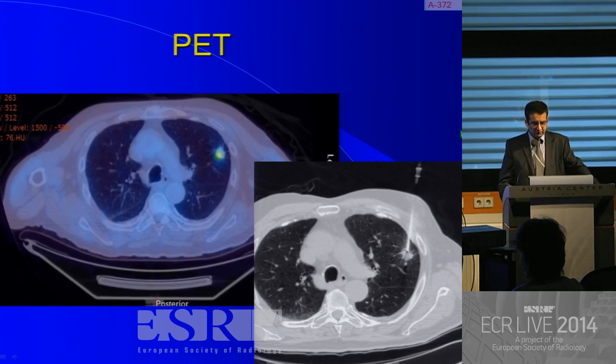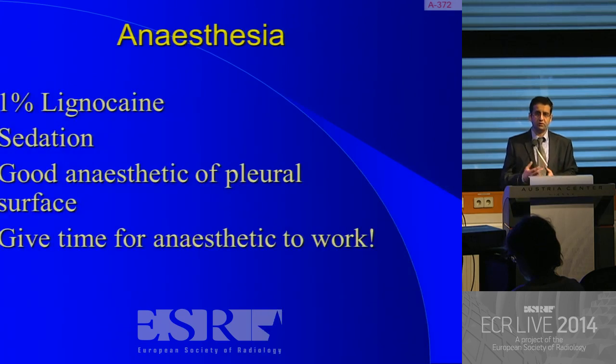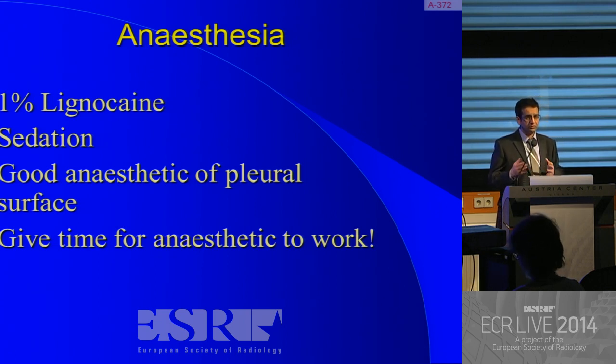When you do a PET scan, you see that the hot part of the activity in this lesion is more inferiorly, more medially, and then you can target your needle better to sample that area, which is likely to give you a better result. Most patients for lung biopsies will have the procedure under local anesthetic and sedation. It's very unusual to need general anesthetic. And more importantly as well, it's important to explain to the patient what you're going to do. If they know what they're going to get, what they're expecting, they cooperate much better.